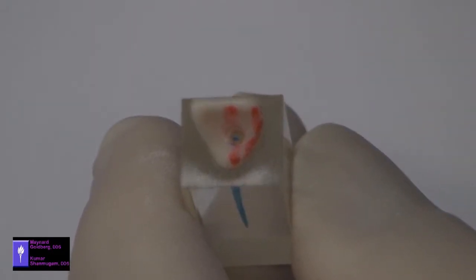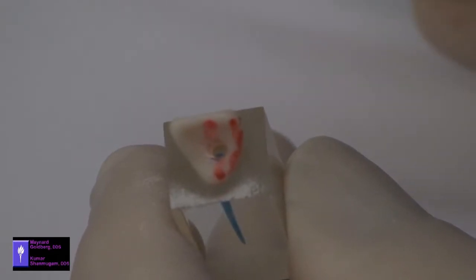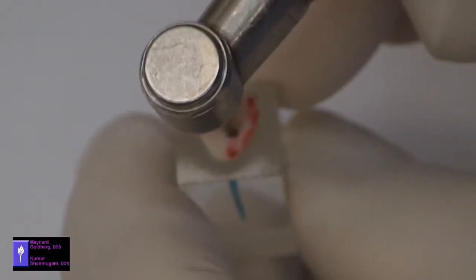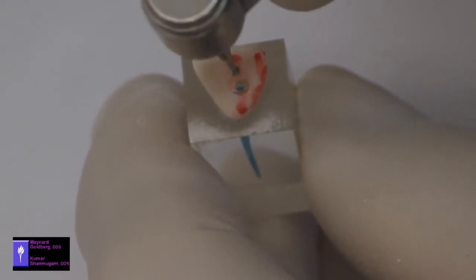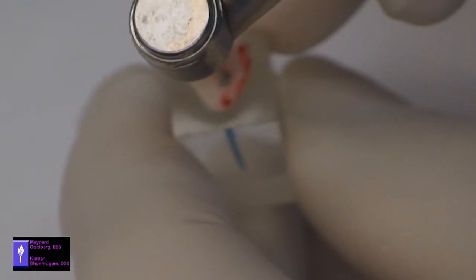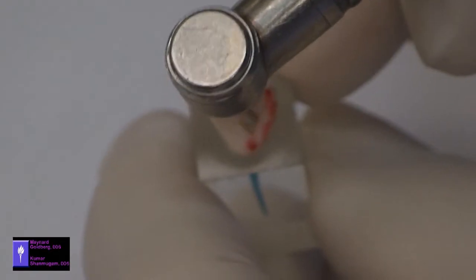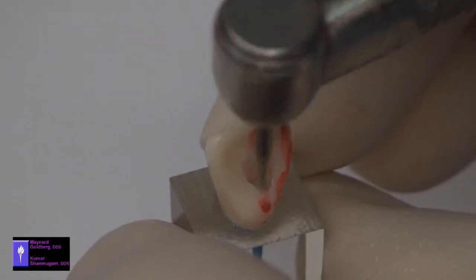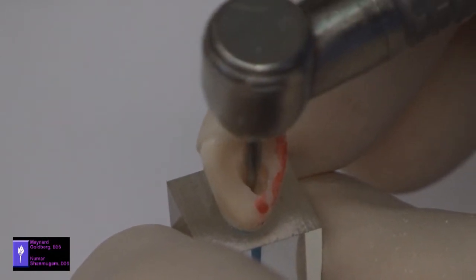And we funnel the walls of the cavity to the height of the incisal edge so that the walls taper from each other. Now the burr is put back into the chamber at the level of the perforation of the roof, and the burr will be brought up in a circumferential manner to the height of the lingual wall. And note, it is still parallel to the labial incisal 2/3 in the lingual surface. The burr is being moved, the handpiece, circumferentially.